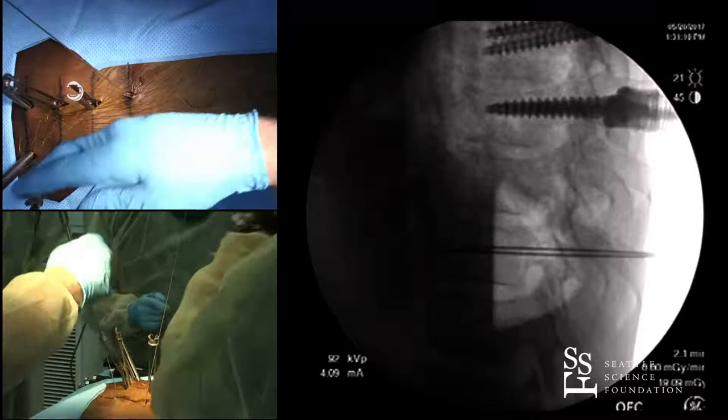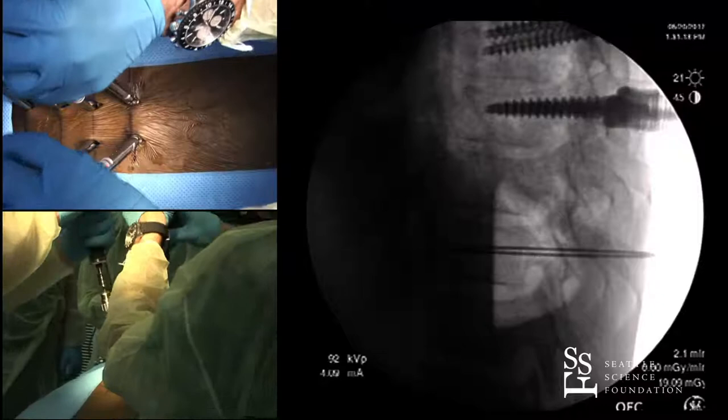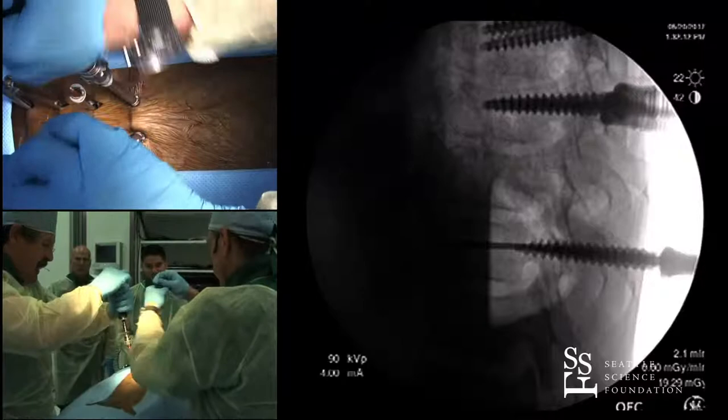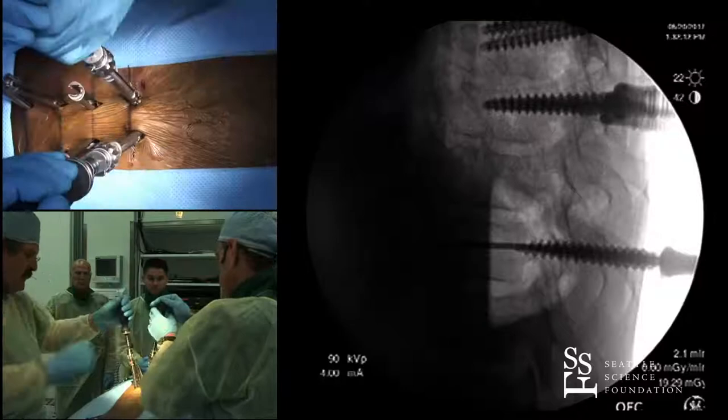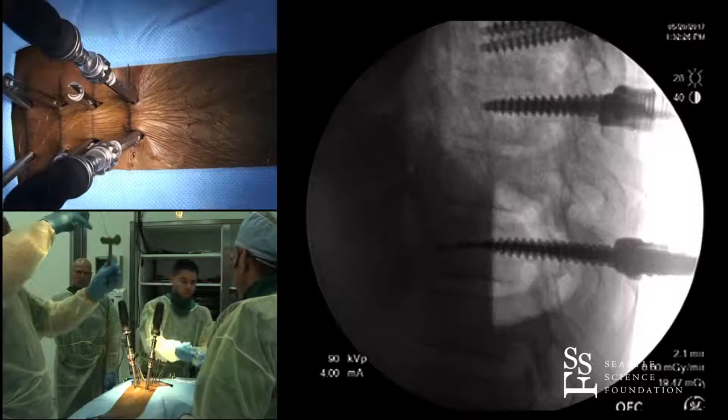In this particular system I don't have to use a tap. We'll put our screws in — based on what you already know, you can select the screw length. We're out of the shorter screws so these are 50s. As we go in, I'll periodically check to make sure I'm not advancing the wire — it can bind up in the screw and advance through the anterior part of the vertebral body. As we get close to fully seated, I'll back out the K-wires before they get jammed up.